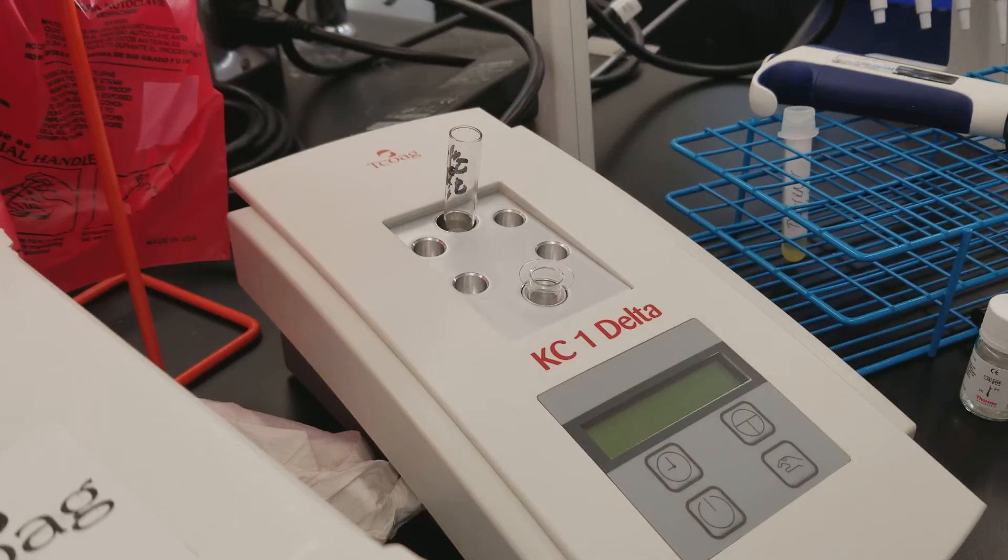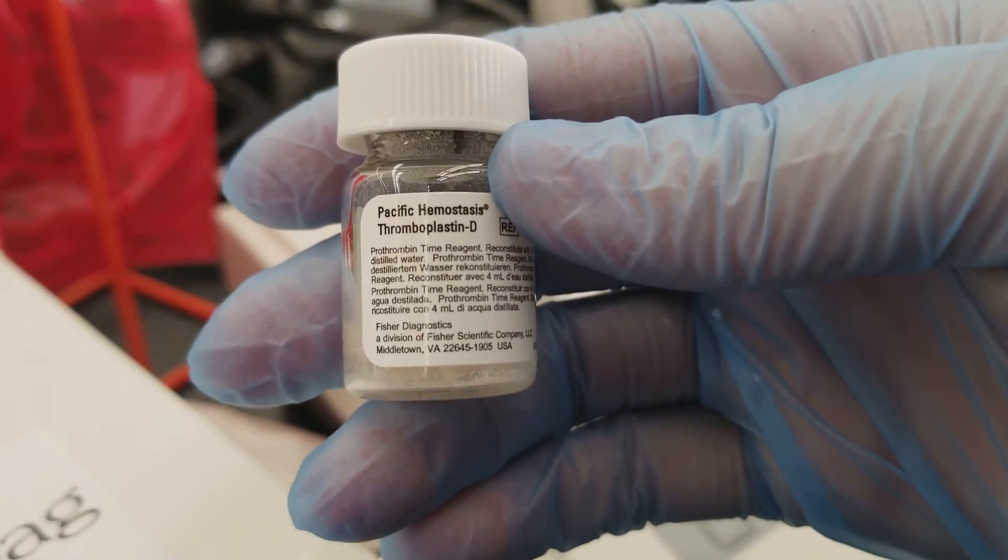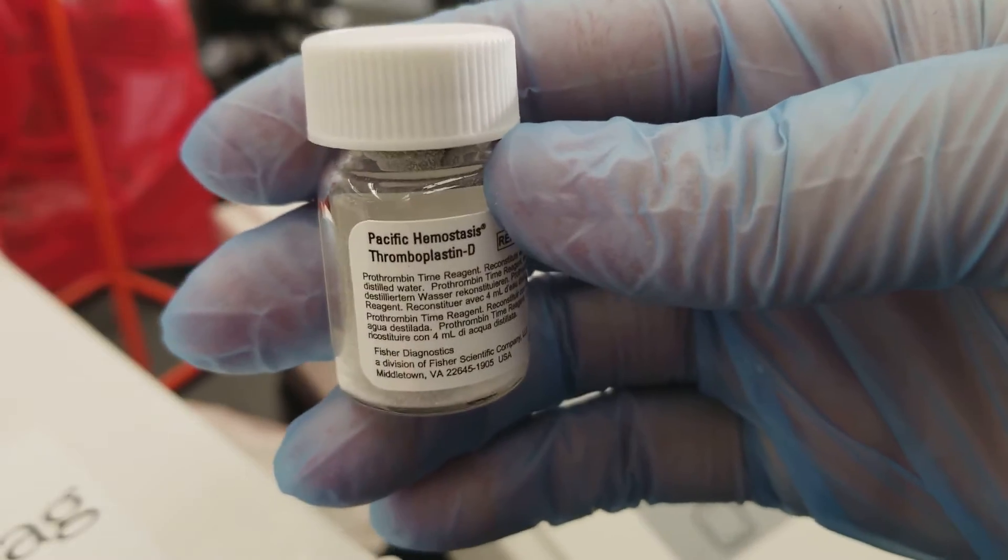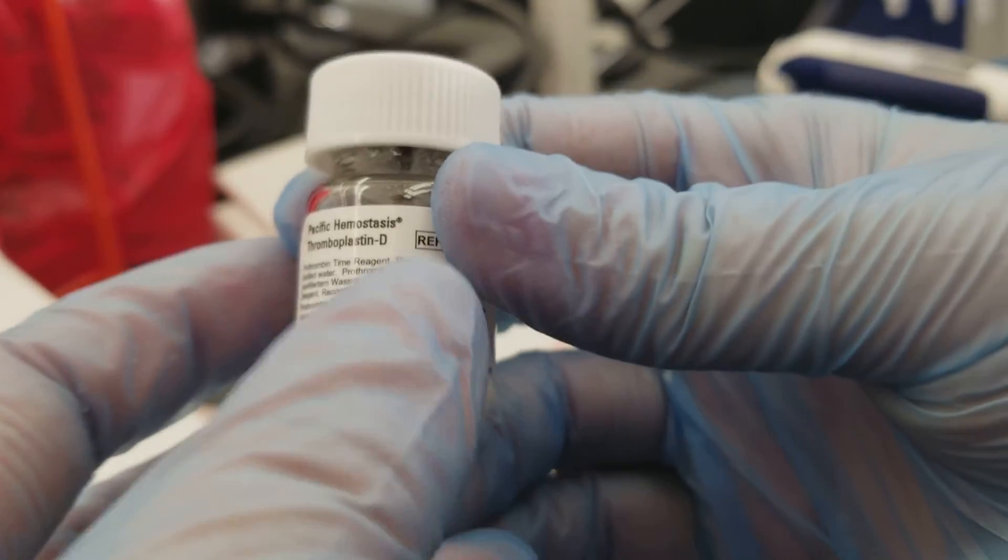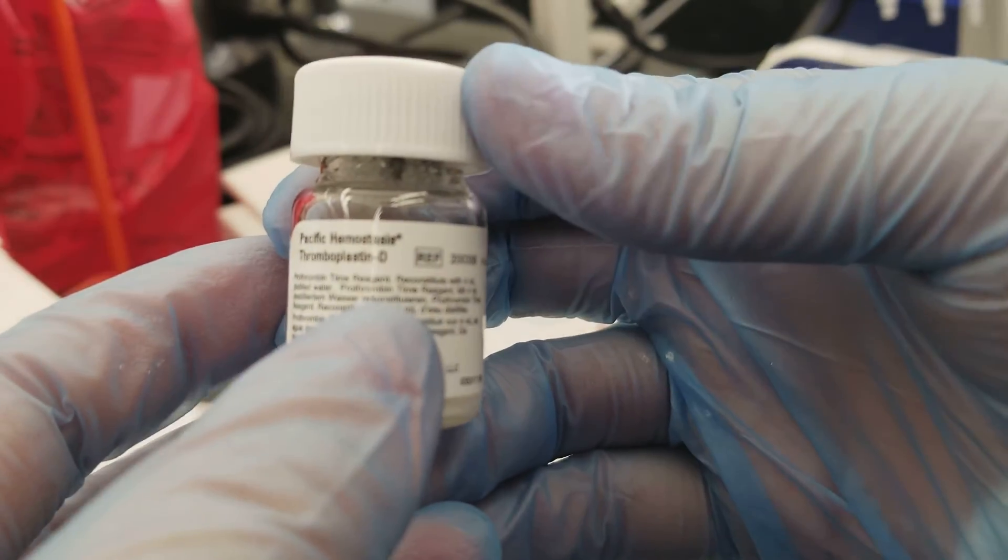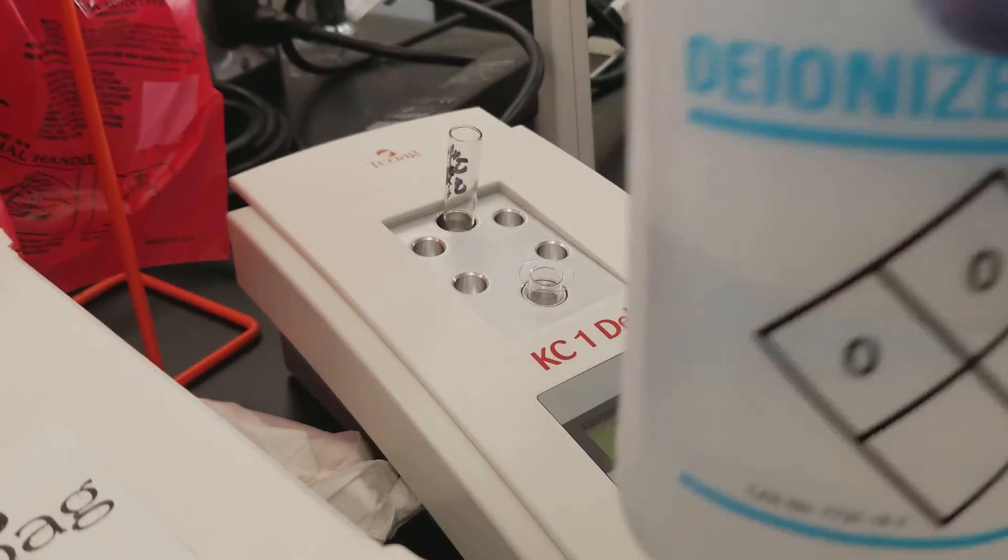Now, I'm setting up one of the reagents right now. This is the thromboplastin, and this is for the PT test. It requires you to put four milliliters of distilled water in there, and so we're using deionized water for this.